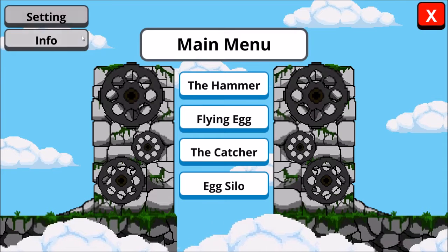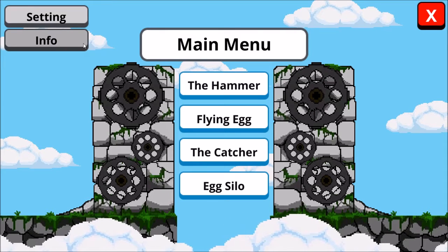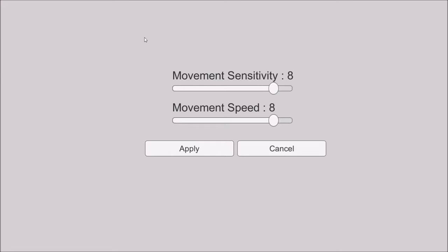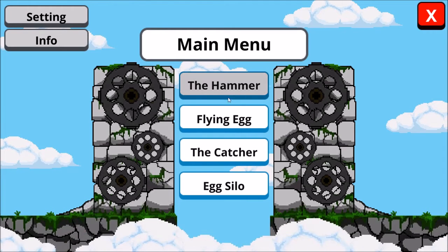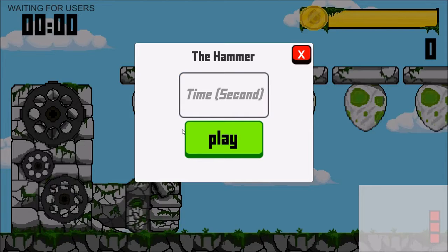This is the main menu. Click on the setting button to open the setting panel. Set the movement sensitivity and the movement speed that suited to the player. There are 4 games for playing.